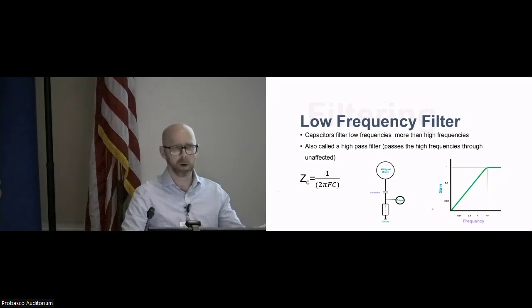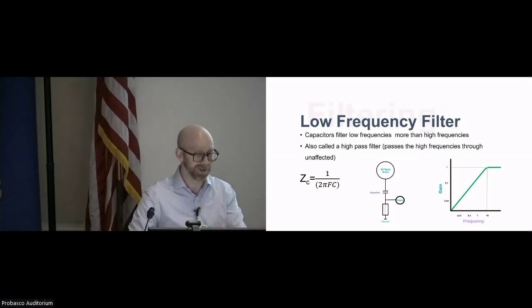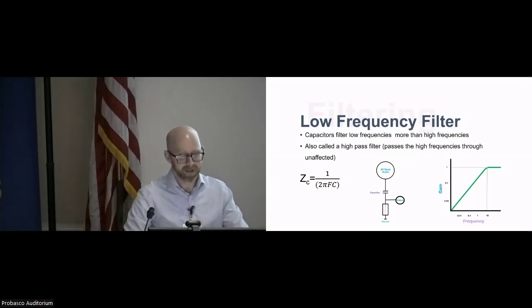And you used to do it all on pen and paper, right? So it was just like an actual printer that would just go as you're doing EEG. It wasn't on a computer at all. So you had to set these filters as you were doing the study back then. And that's obviously hard because you can't really go back and redo it. It's done, so if you disagree with how it was filtered, it's too late.